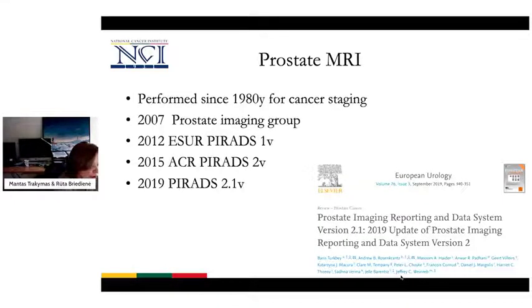I will talk about prostate MRI, and my talk is orientated both to radiologists and urologists, just to understand how we use prostate MRI and how we score it and what's important to know. So talking about prostate MRI, it has been performed since 1980.